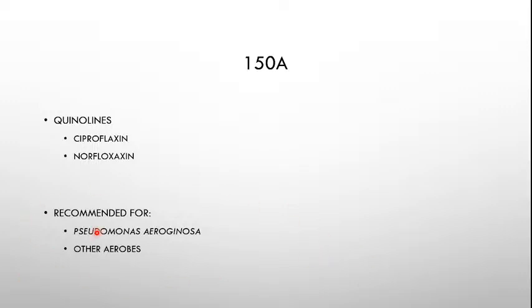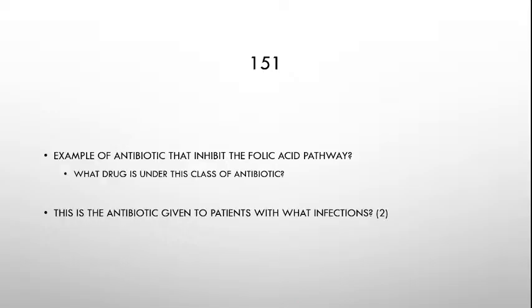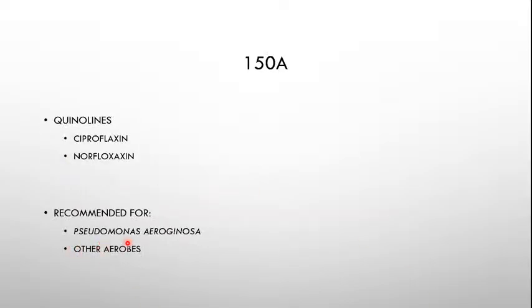Okay? But again, there's a different set for gram-negative non-fermenters, sorry. Oxidizers dapat. Yung mga kapamilya ni Pseudomonas like Acinetobacter, yung mga ganyan. Mga kapamilya niya yan. Kasi halos parehas yung reaction nila with TSI.